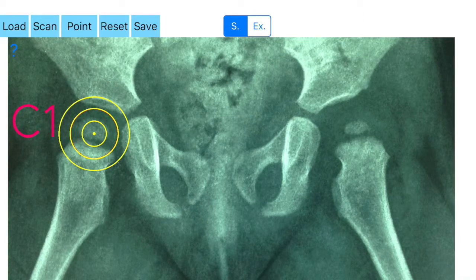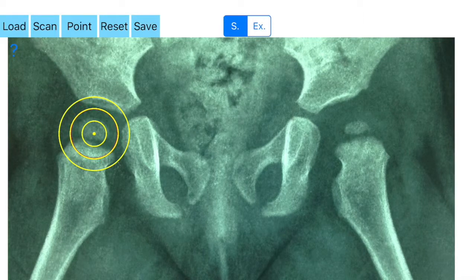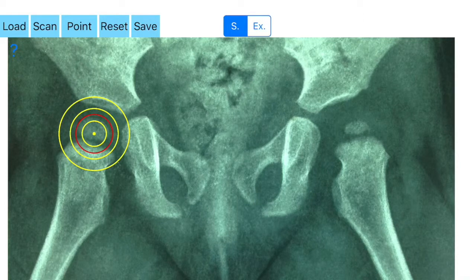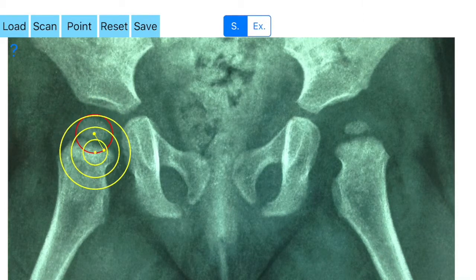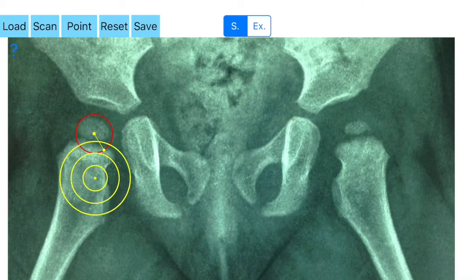C1 is marked. Next, a dynamic red circle appears with the C1 center point marked on screen. The radius of the circle changes dynamically, and by moving the attached finger, you again find the best-fit circle to the contour of the femoral head circumference. Once you find the best fit, you press the point button and the whole femoral head is marked by the red circle.